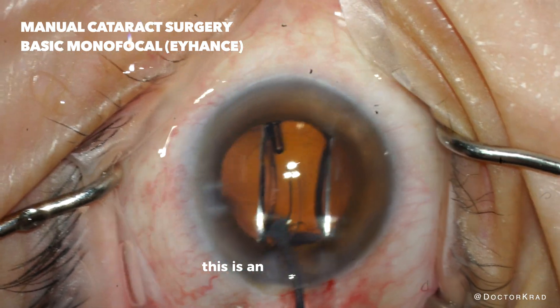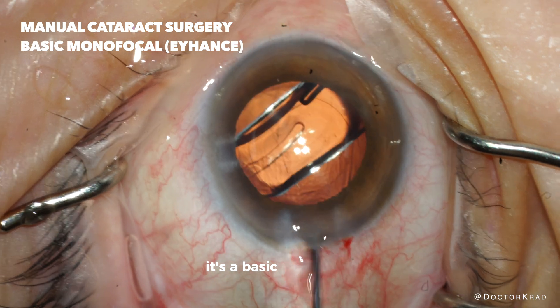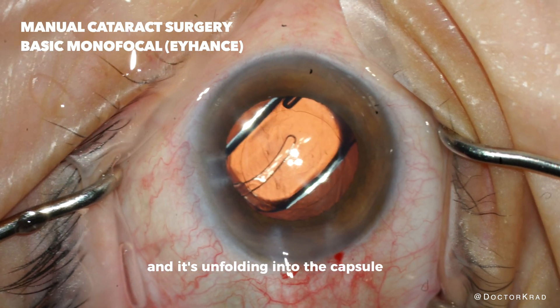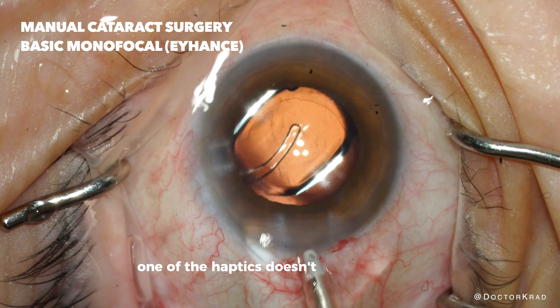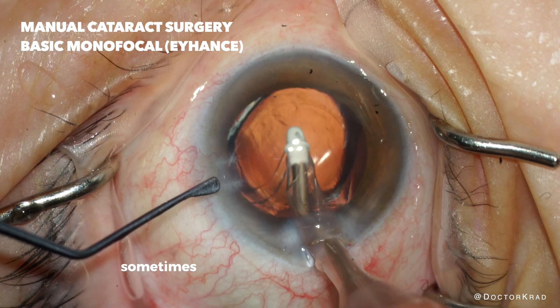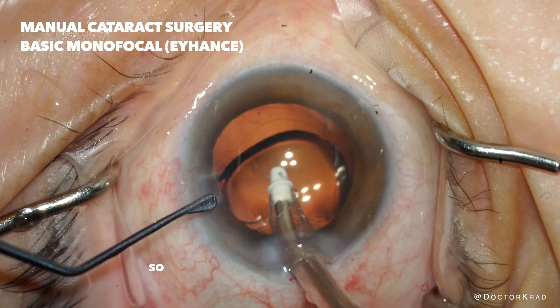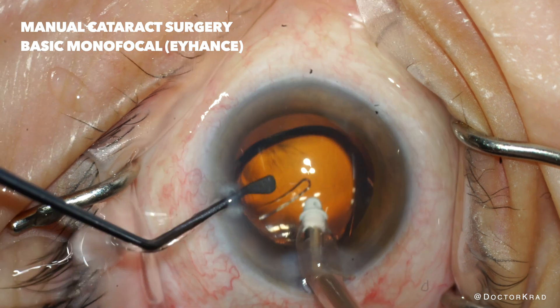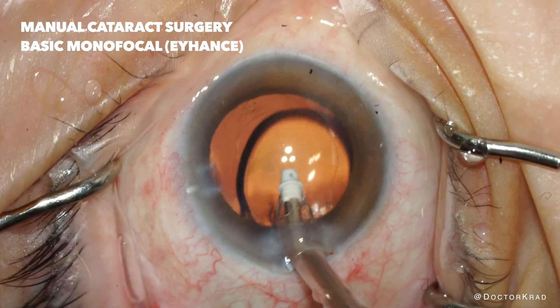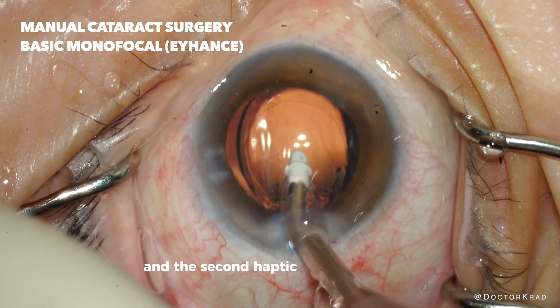This is an Eyhance lens — a basic monofocal — and it's unfolding into the capsular bag. One of the haptics doesn't want to unfold, which is common with this lens platform. Sometimes you need to encourage it to unfold, so that's what I'm going to do right now. And there — the second haptic is now unfolding.